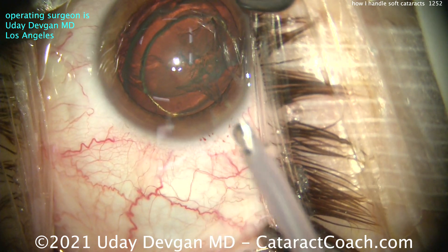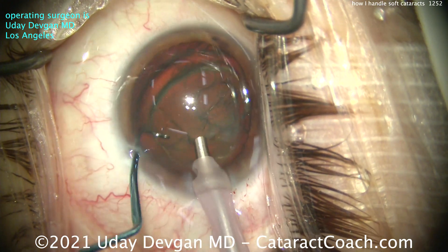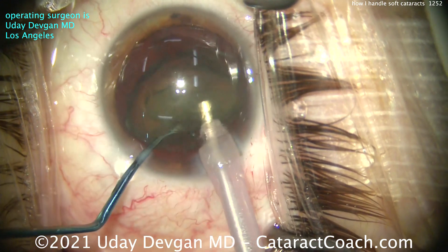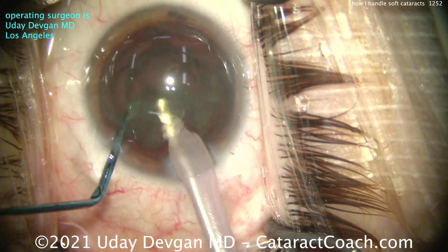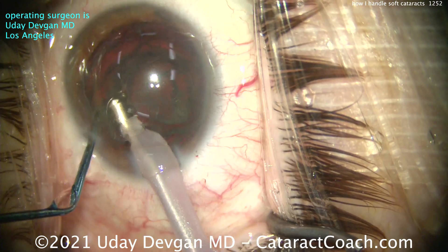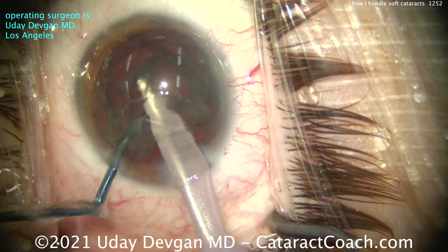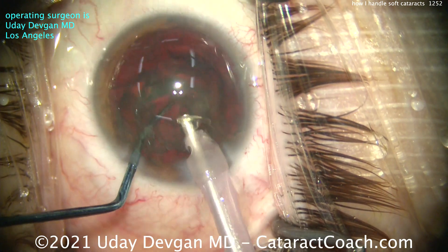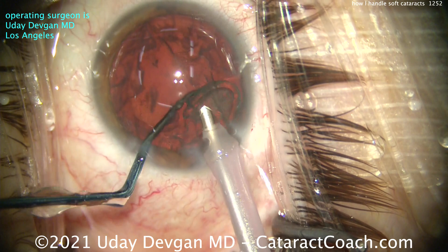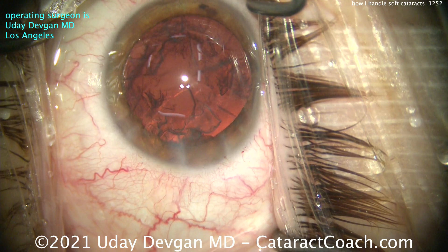How much faco energy do you need here? Basically none or minimal. Putting the faco probe in the eye here — don't even try to chop it. Just use the chopper to push the piece in front of the probe. Your goal is to occlude the probe with lens material, keeping the vacuum high, and then this just emulsifies very easily. You may need zero faco power even. The key is to have balanced fluidics so you have a good stable anterior chamber, and keep the capsular bag away from the faco tip. Just like that, the nucleus is gone.